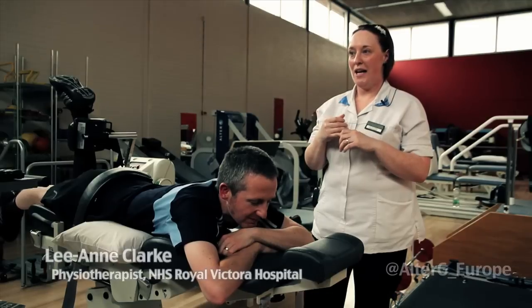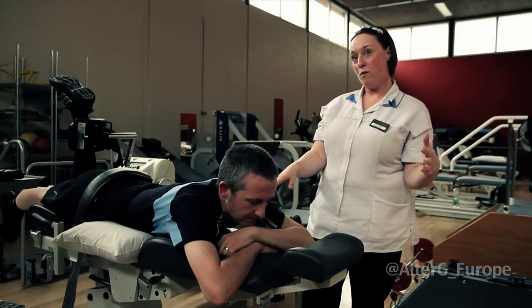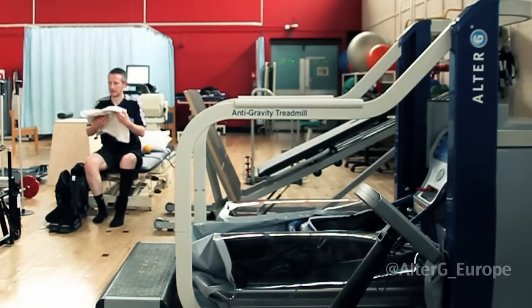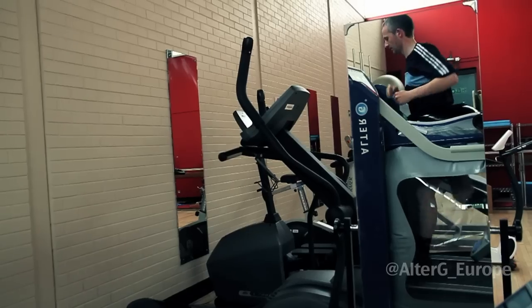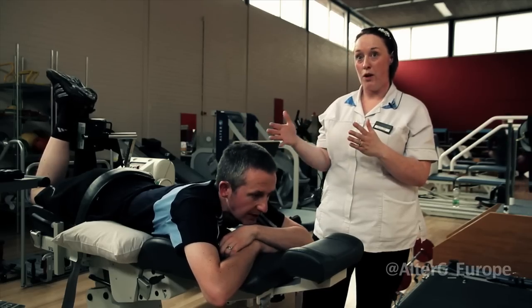It's been an invaluable resource. Even for Paul — in the early stages when he came to me he wasn't allowed to weight-bear for three months, so we were very limited in what we could do. If we had the AlterG at that time he probably would have been up walking normally much earlier.